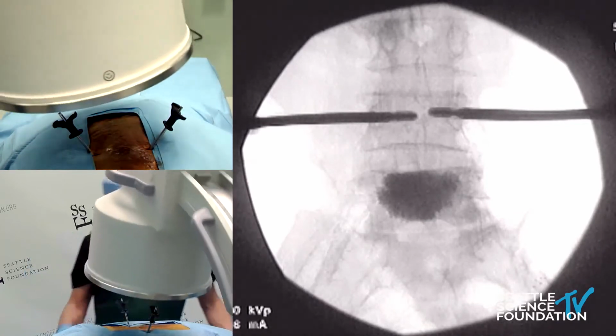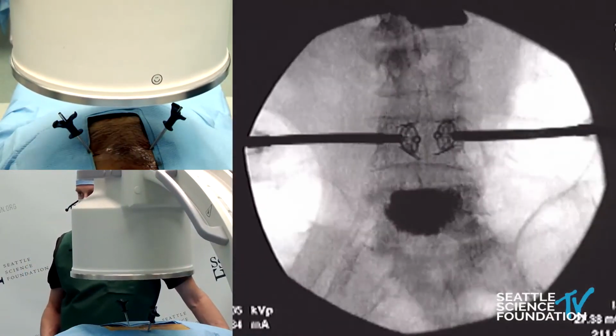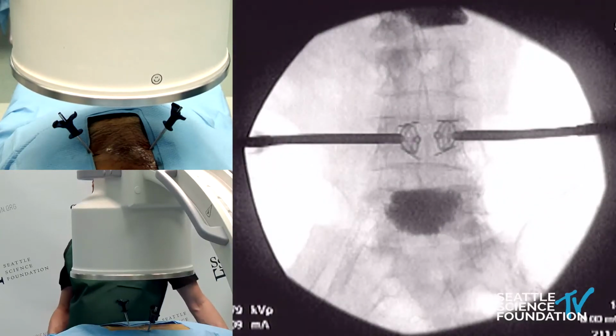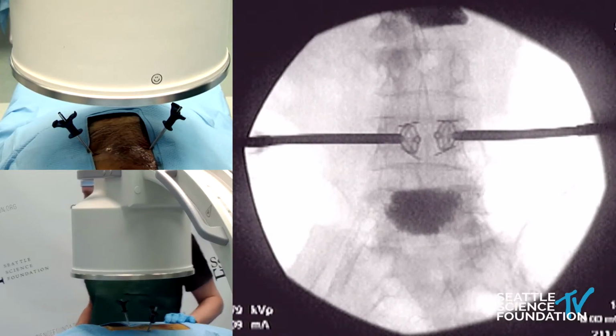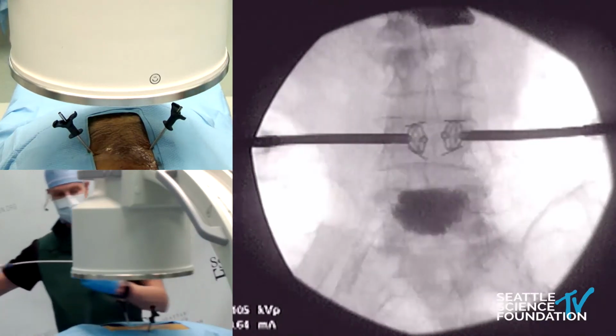There's a little bit of plastic bowing deformity. This is a titanium implant, and these are appropriately bowed. And that's beautiful, right there in the middle. And we'll inject cement on both sides. Fully deployed spine jack. And let's go back lateral. Thank you, thank you.